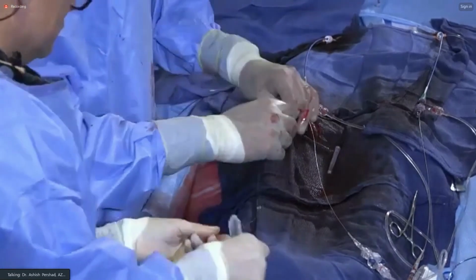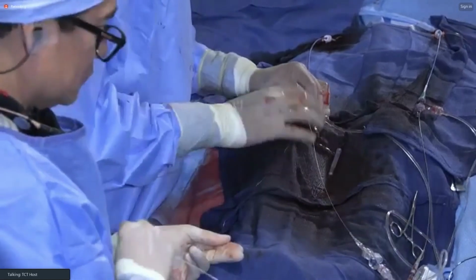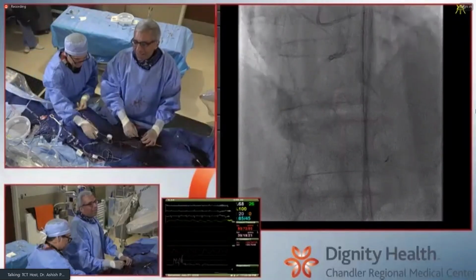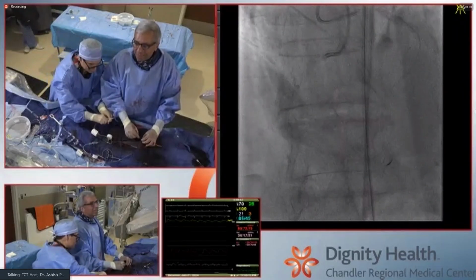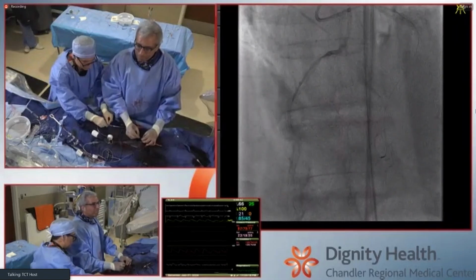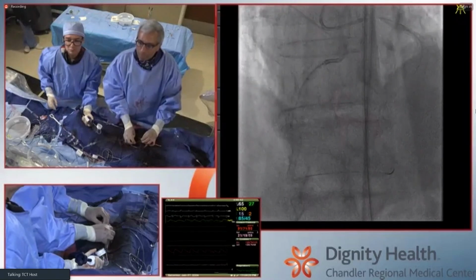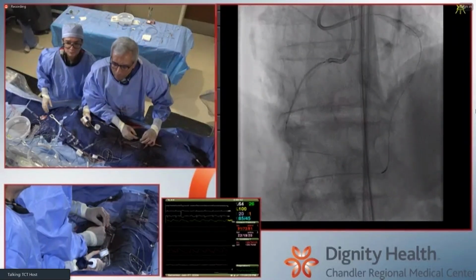Going up with a 3.5 now, approximately. The comment here is, is IVL helpful in this scenario? In my experience with these, I don't find that, because if an NC balloon doesn't expand, if there's evidence of deep calcium, it's different, right? But if it does expand, what you're talking about then is fracking a half of the vessel, which doesn't make a whole lot of sense to me if the other side of the vessel is principally not distensible. The acute result is fine. It is the chronic stent recoil.